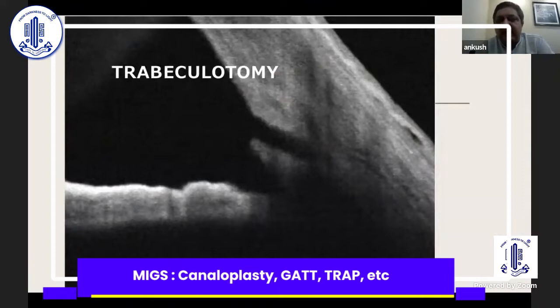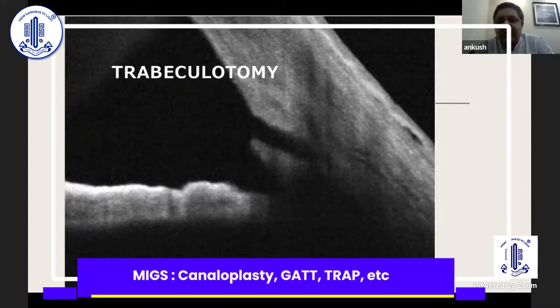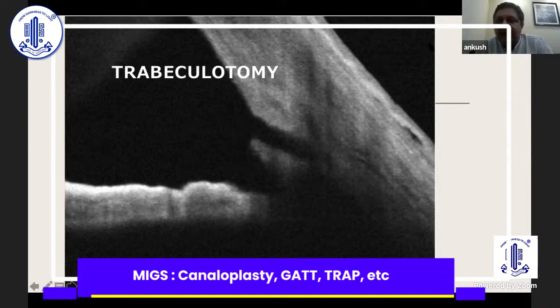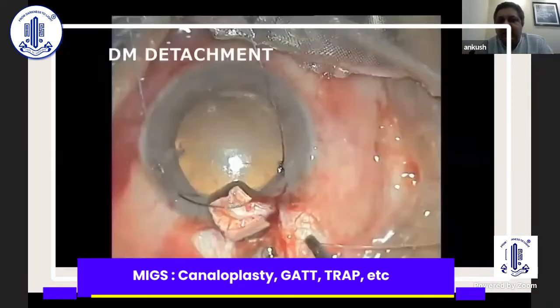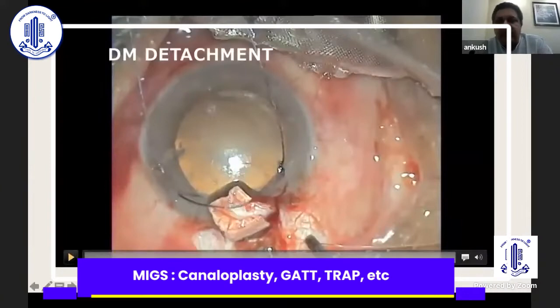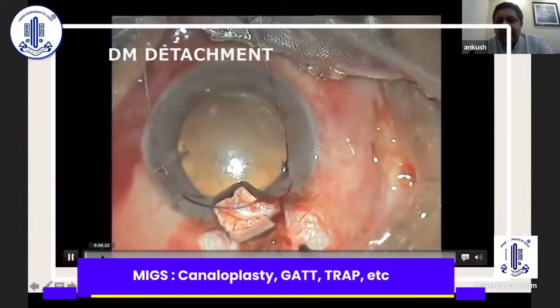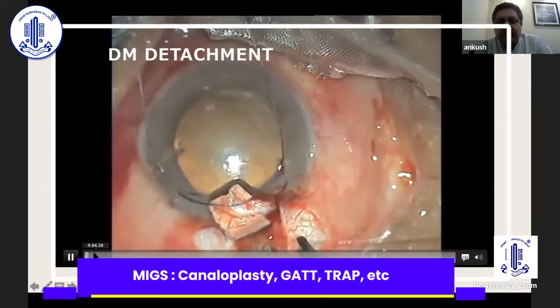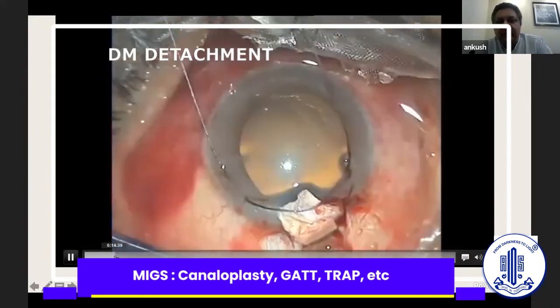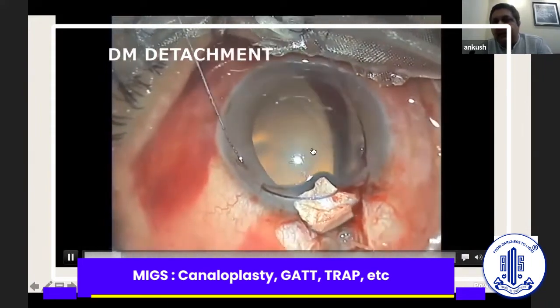The second procedure I do normally is trabeculotomy, either ab interno or ab externo. This is also a simple procedure — same thing, you have to cannulate the canal either using a suture or a catheter. The difference is that when you pull the sutures or catheter together, they cheese-wire through the canal and create a fistula between the Schlemm's canal and the anterior chamber, thus helping in egress of IOP. In this case, everything was going very well. I passed the catheter through, but when I pulled the two ends of the catheter, I had a Descemet's membrane detachment.